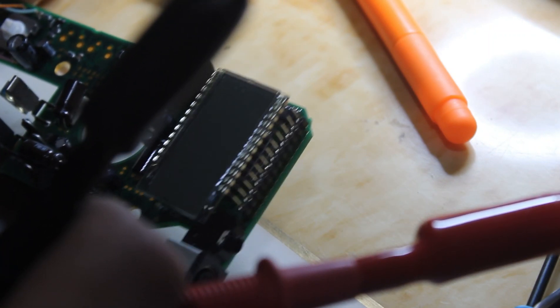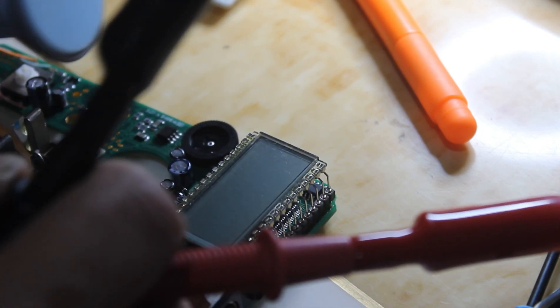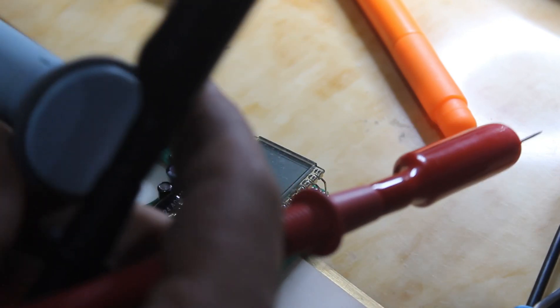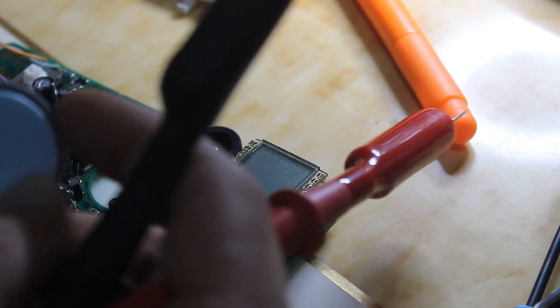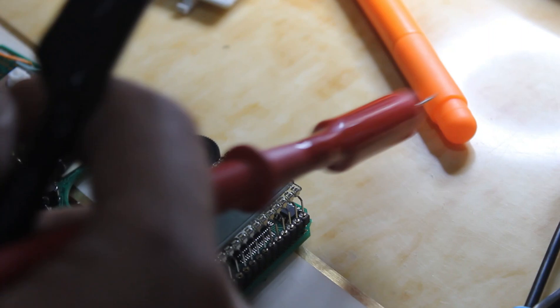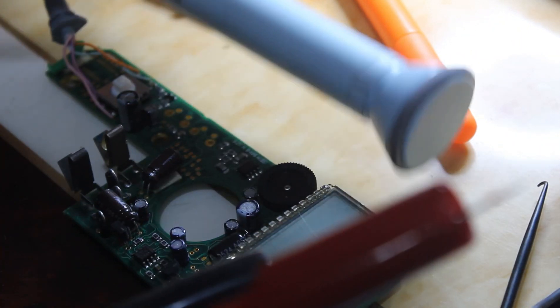This is the Doppler device. This is the probe of the Doppler. We can change the head — this is a two megahertz probe. We can change to five, ten, or fifteen megahertz, depending on the doctor's preference.